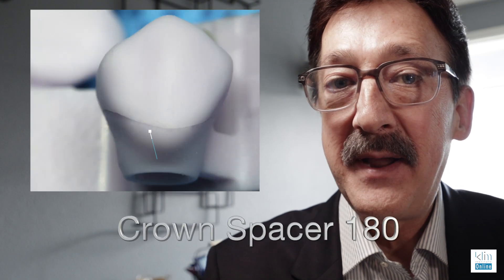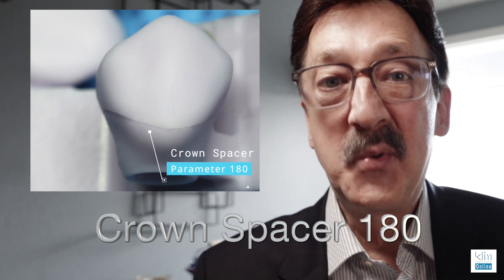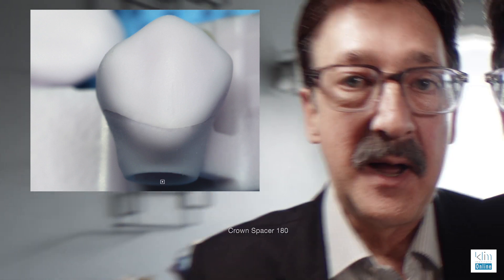Number one: I want a spacer at 180 versus 120. That 180 kind of solves that problem.